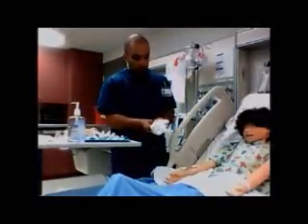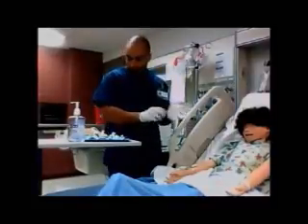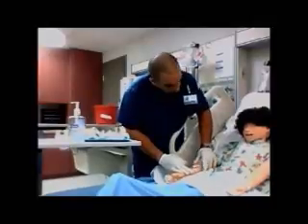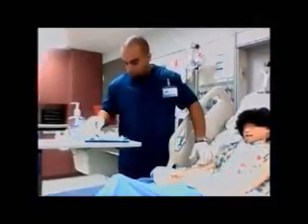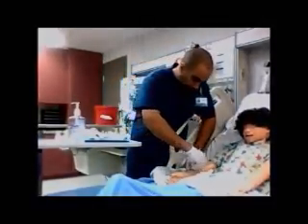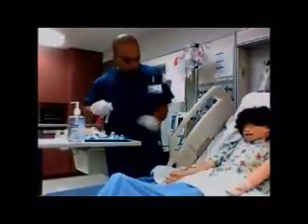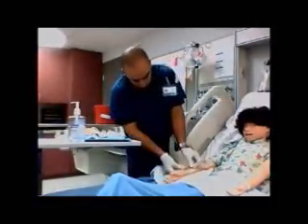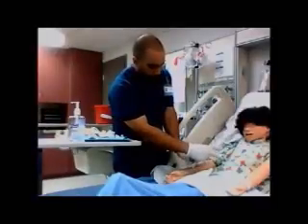He applies non-sterile gloves and inspects the IV site for redness, swelling, edema, pain, discomfort, or dislodgement. He then takes 3 alcohol pads and cleanses the saline port. He attaches the normal saline flush, unclamps the lock, aspirates for blood, and pushes the saline into the catheter.